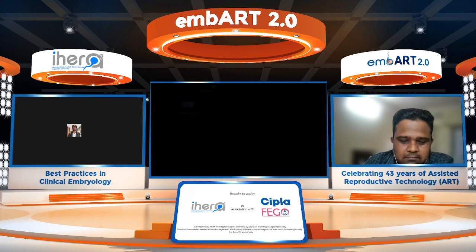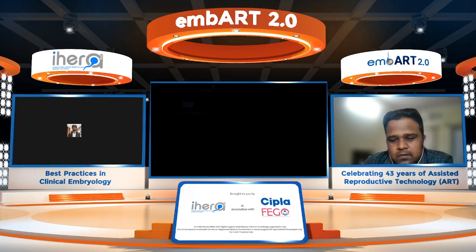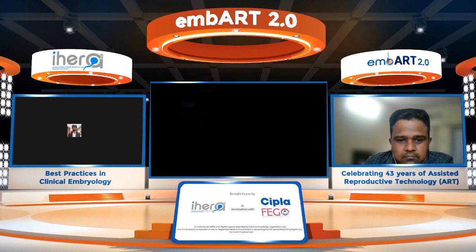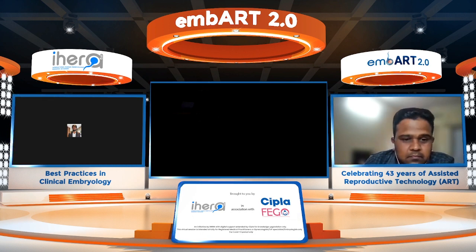And in a recent 2020 RCT paper, they went straight into an ICSI dish: you have media drops, put a fresh ejaculate in a few drops, and from the third drop you can get your good functional sperm and do the ICSI right there. That is just a horizontal migration technique. By migration, they say we can still get a functional sperm, equivalent to what happens in the cervical mucus in the female reproductive tract.